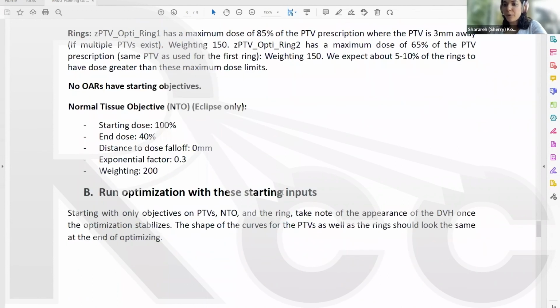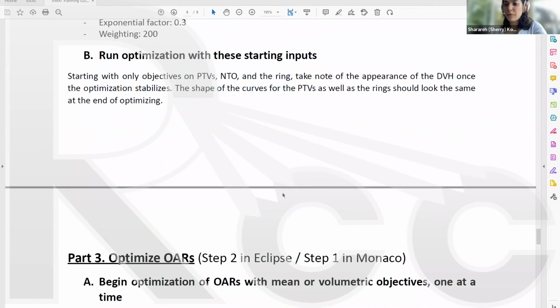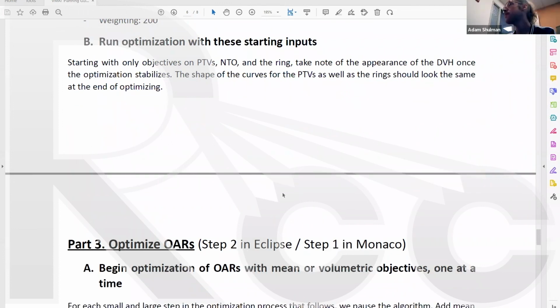Awesome. And I think we do have one more question talking about highly modulated plans. Do you set a maximum MU number? I do not. Again, because you'll find as you practice this process more, and it only takes you one iteration, and you have no conflicting arguments, it's easy for the optimizer, you're going to have really low modulation factors. And so you're not going to have that issue.